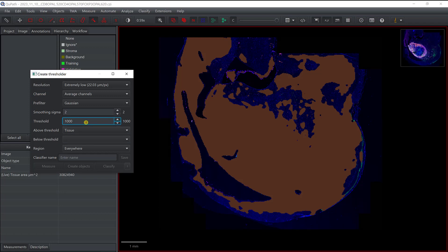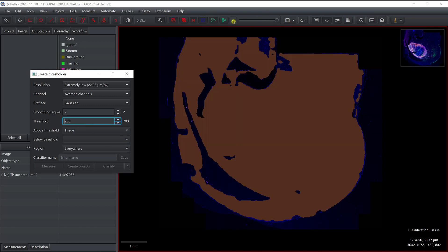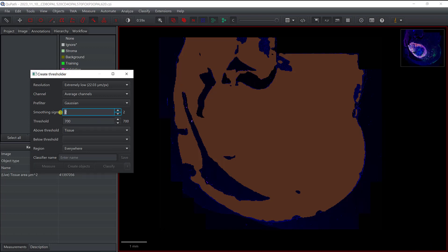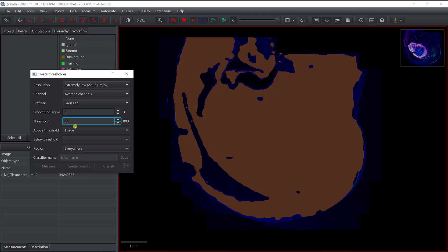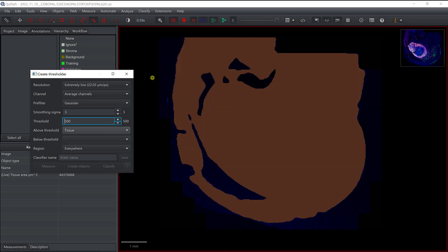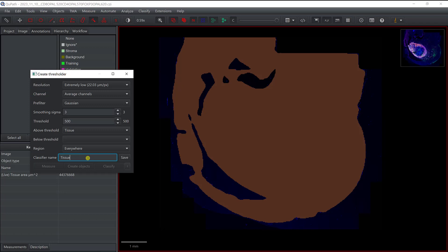A value of 1000 is probably too high, so let's try 700 — that looks pretty good. We're still missing some tissue, so I can increase the smoothing for more regular regions, but I'm still missing those areas. So I need to decrease the threshold to about 500, which actually looks pretty good. I'll define a classifier and call it 'tissue classifier' and save it.